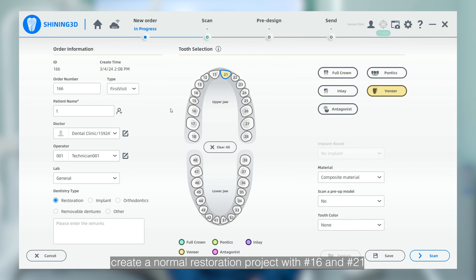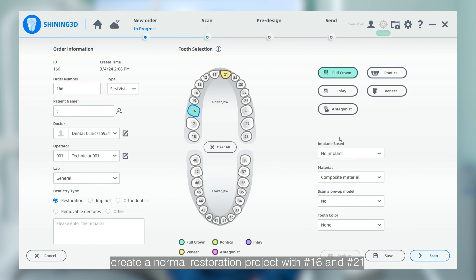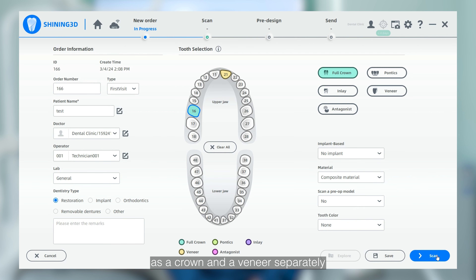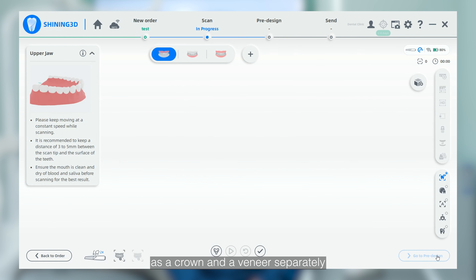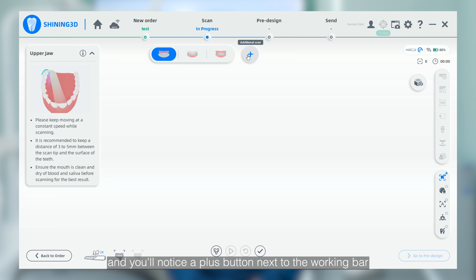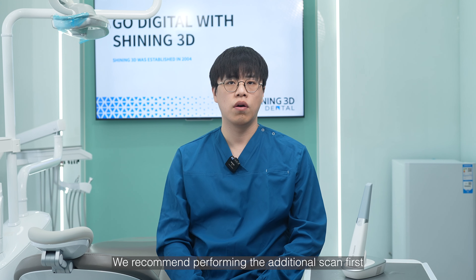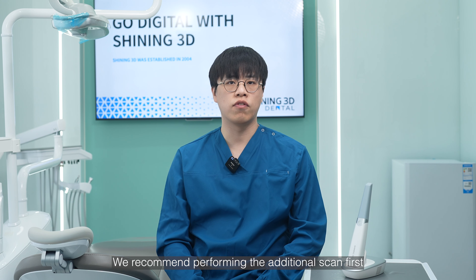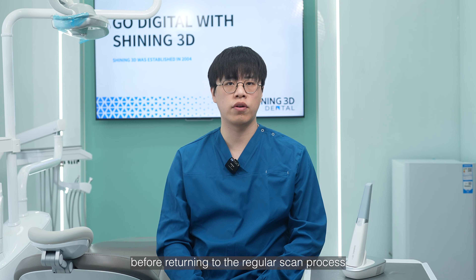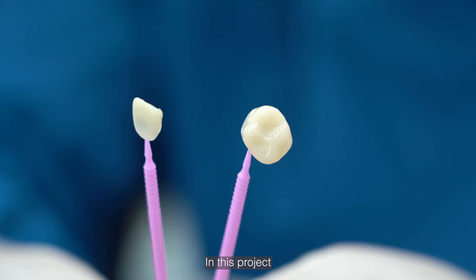First, create a normal restoration project with No.16 and No.21 as a crown and a veneer separately. Enter the scan step and you will notice a plus button next to the working bar. We recommend performing the additional scan first before returning to the regular scan process.